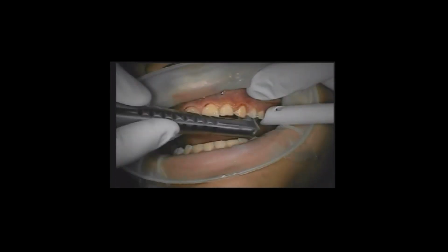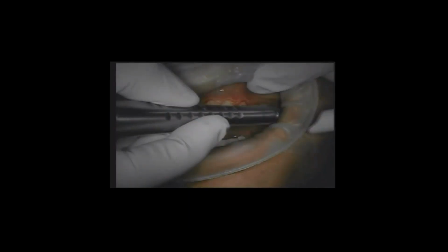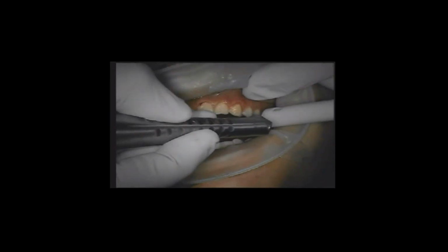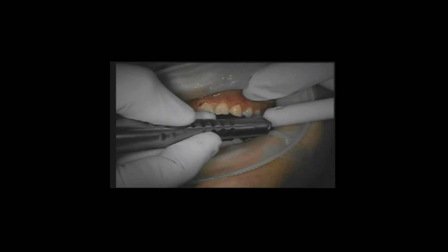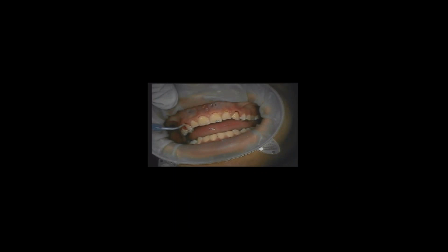So we like to make a second set with an impression immediately after we're done with this procedure, and then they've got that retainer within 24 hours. Typically, we'll schedule this in the morning, and then we'll have them come back in the afternoon or towards the end of our day and deliver the retainer.